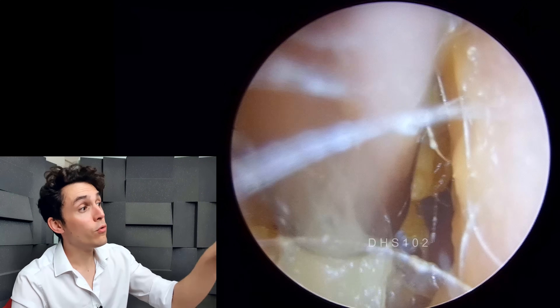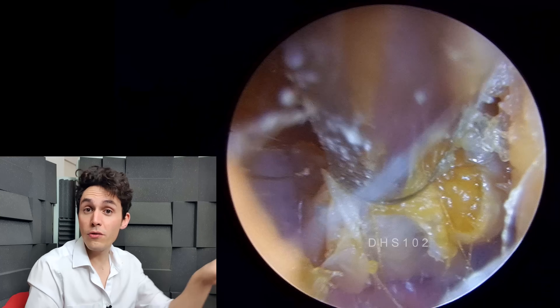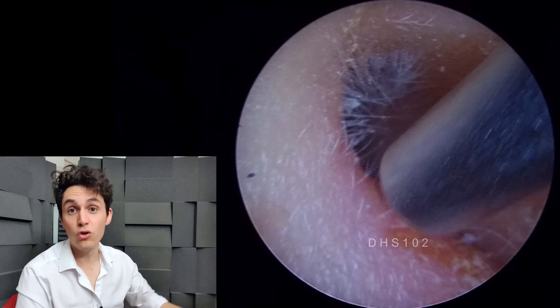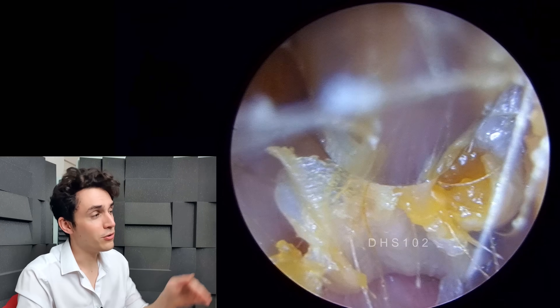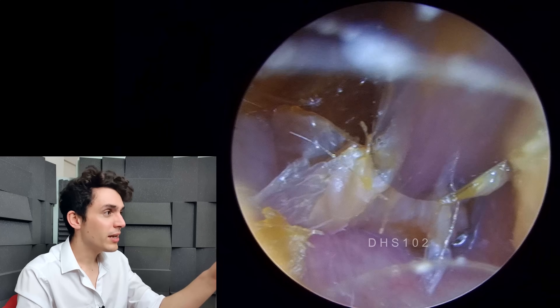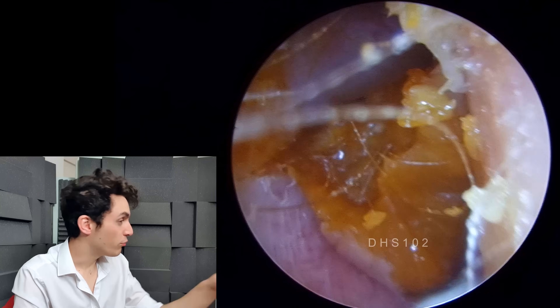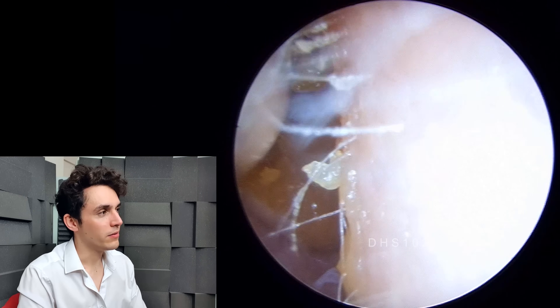This is the normal ear — the non-infected ear on the patient's other side. I thought I would show you the non-infected ear first, because this gives you a good idea of what's normal for the patient. There's a little bit of redness and dry skin around the outside near the entrance to the ear canal. But if we look here, there's dead skin, there's ordinary yellowish-brown wax in the ear canal.